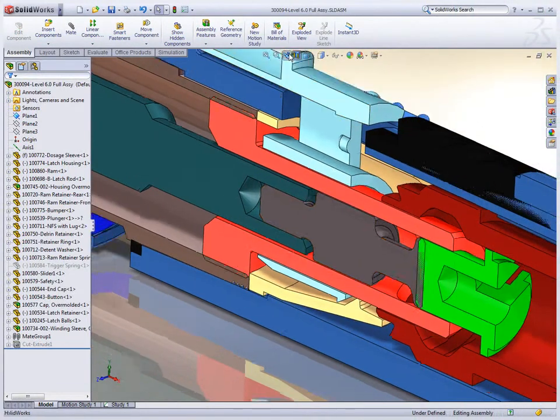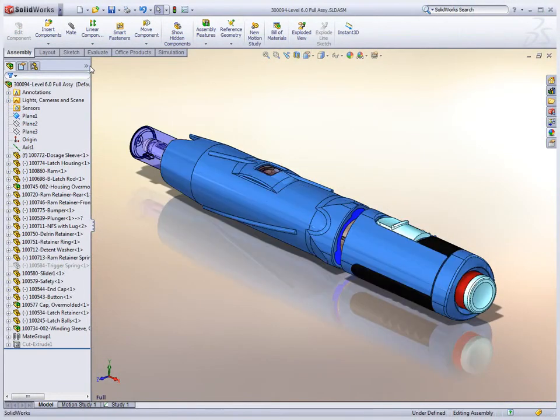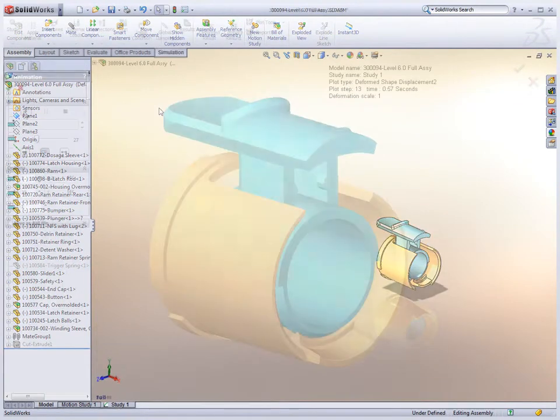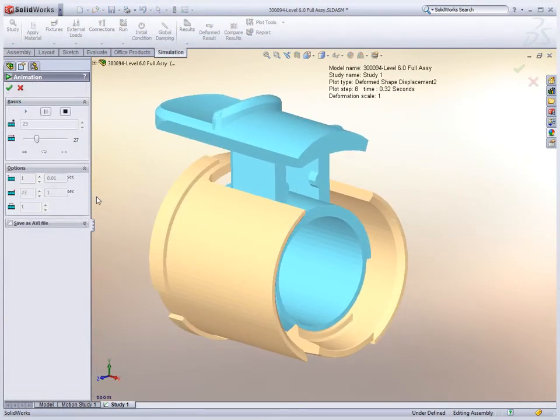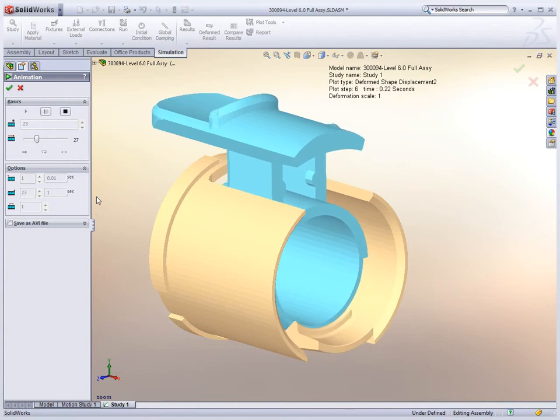Simulating real-life product testing in SOLIDWORKS dramatically reduces the number of physical prototypes needed. How parts move and interact, or how strong they need to be, are all factors that affect design decisions.